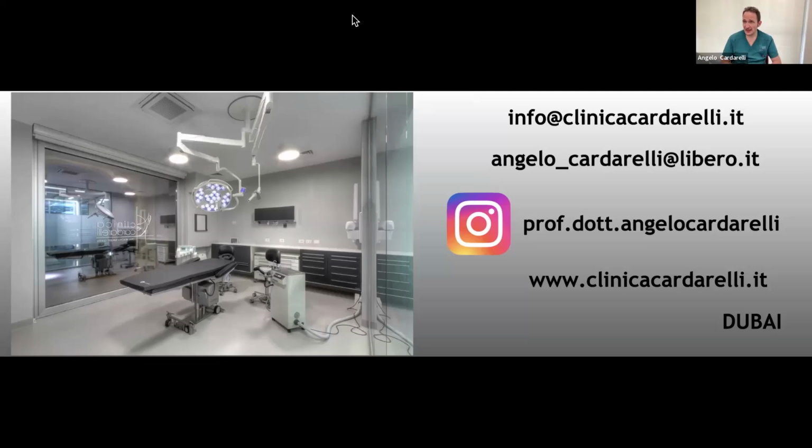Do you mean a surgical guide? No, this is not a surgical guide procedure. This is open flap. I don't use any reference. This is the open flap procedure. So after the implant placement, we can use the scan body and that's it. But I don't use any markers, if you mean that. No. CBCT for the diagnosis, but no CBCT for the surgical guide because this is the open flap procedure. So I don't use any kind of markers, if I understand your question.